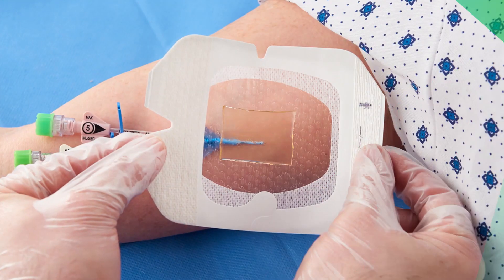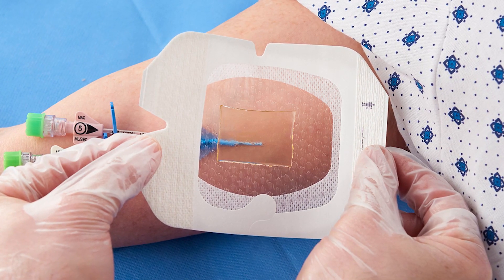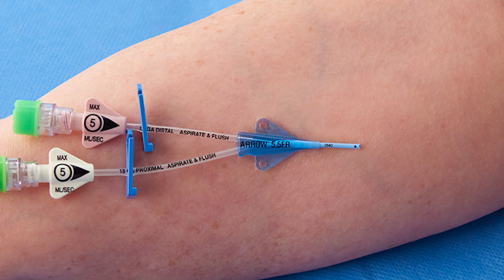Before applying the dressing, ensure that the gel pad will be able to be centered over the catheter insertion site on dry, healthy skin. Prepare the site according to your facility's protocol.